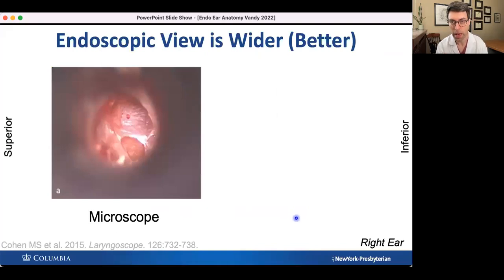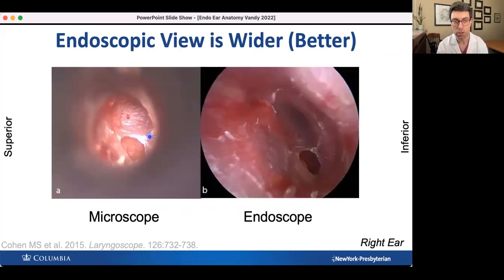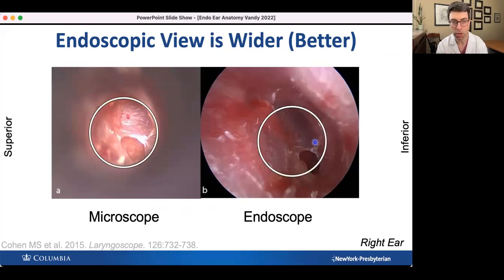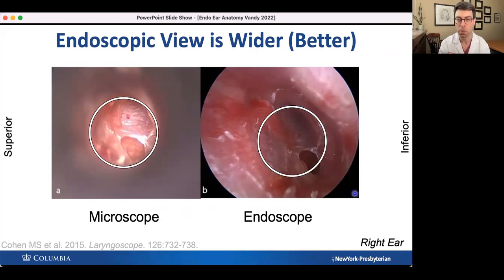Here's an illustration of that. Here is an image of a tympanic membrane perforation with the microscope — here's the perforation, and much of your view is simply the metal speculum. Here is the same tympanic membrane perforation as viewed with the endoscope. The white circle denotes the microscopic view overlaid over the endoscopic view. With the endoscopic view, you can also see the annulus and the ear canal. It's just a better view.